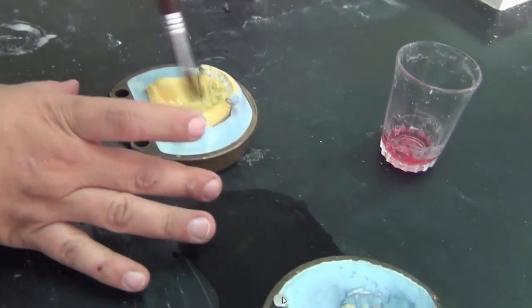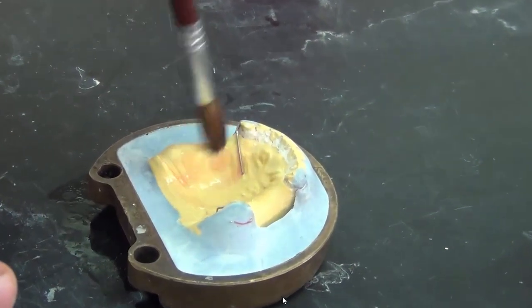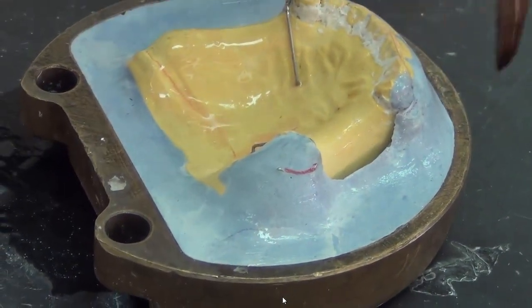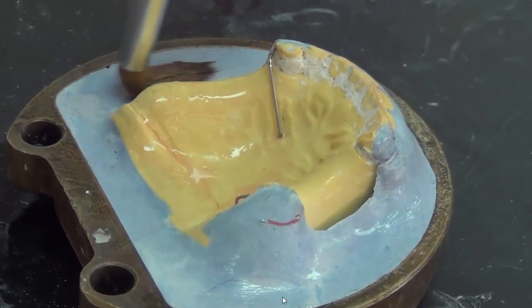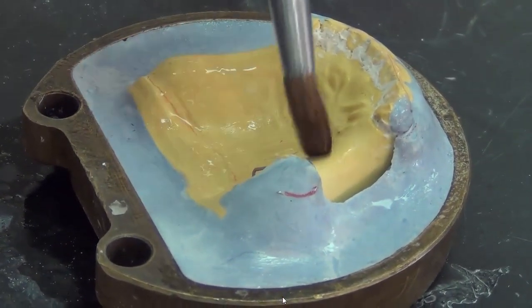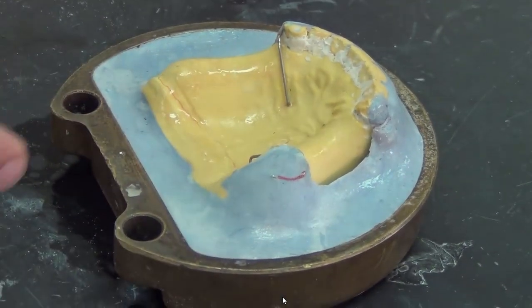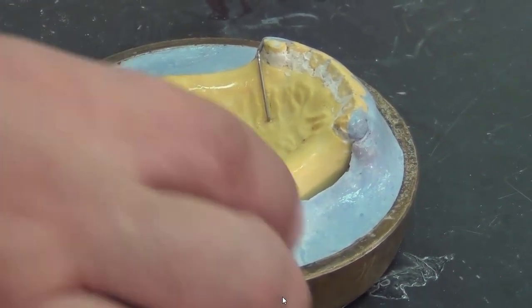For the lower member, we paint everything: the rims, the cast, the lower part of the cast, the plaster layer around. We make sure that we paint the separator very well, and usually it's done in 2 steps. So it's still warm. We have painted the first layer, and the warmth of the cast will accelerate the reaction further, and it will set dry. And we're going to paint a second layer.